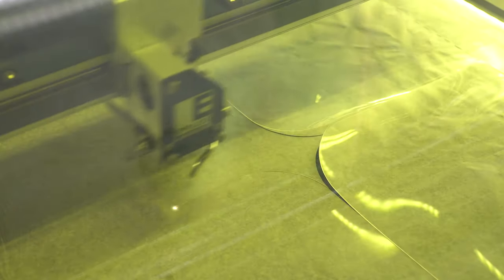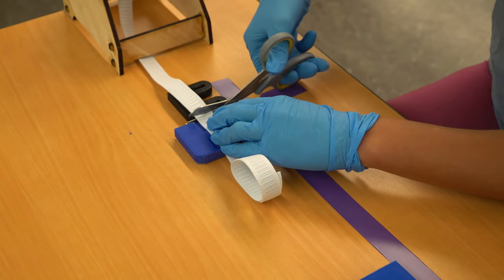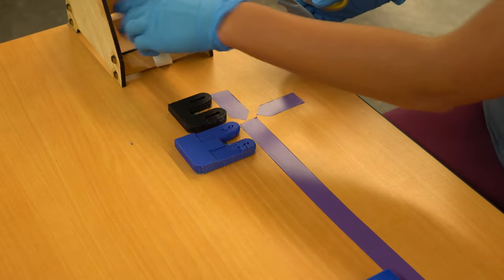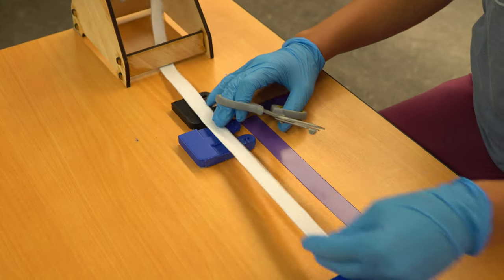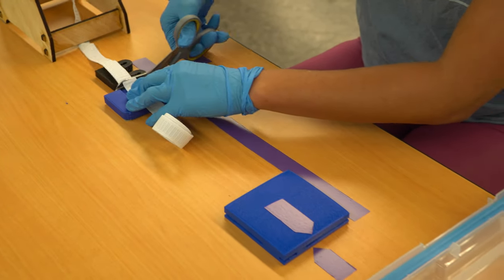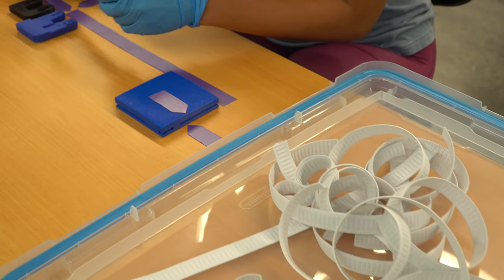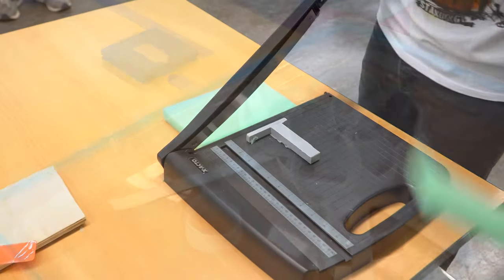Laser cutter files are going to be provided free of charge. Elastic ribbon should be cut using a jig or something that pre-measures a set length of ribbon. A very large collection of ribbons can be cut in a very short order of time using this method.